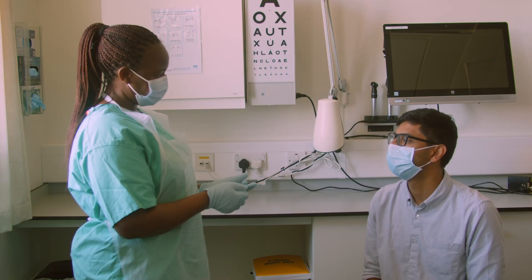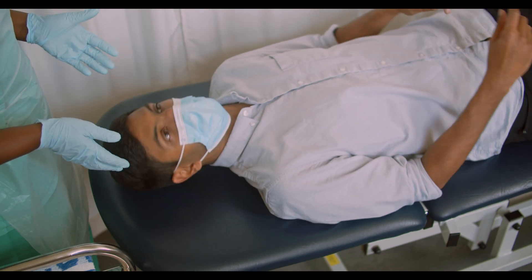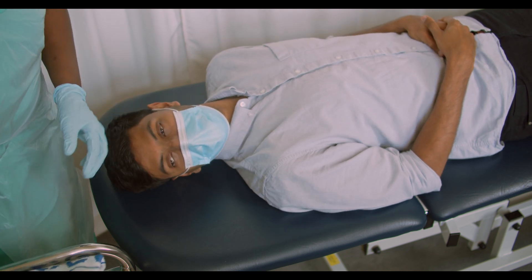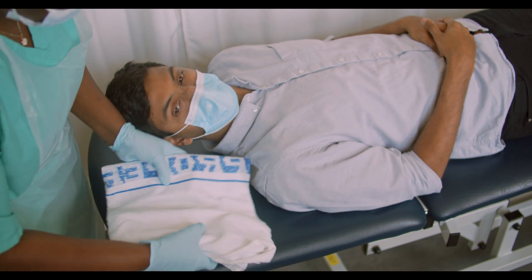Explain what you're going to do and gain consent. Lie the patient down and get them to lean back on a seat. Tilt the head to the side of the affected eye. Place a towel and bowl to soak up fluid.